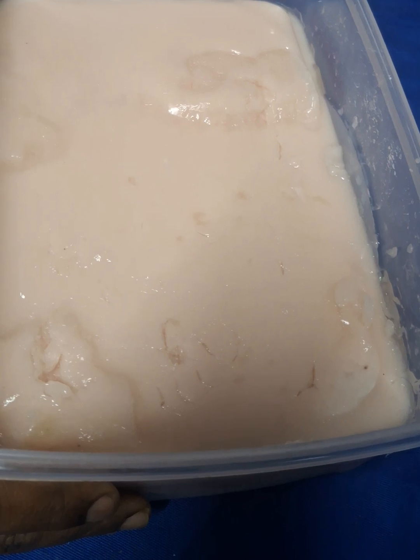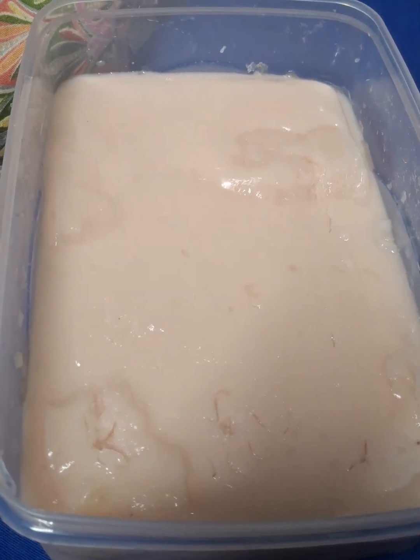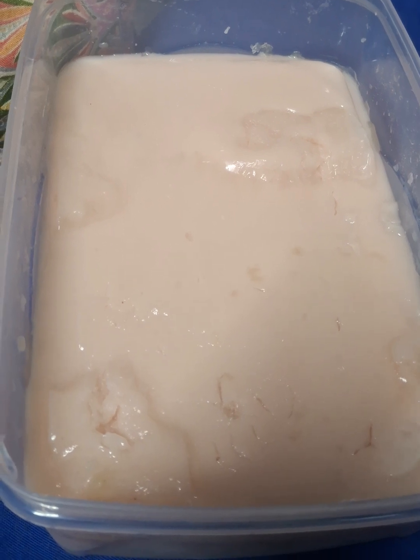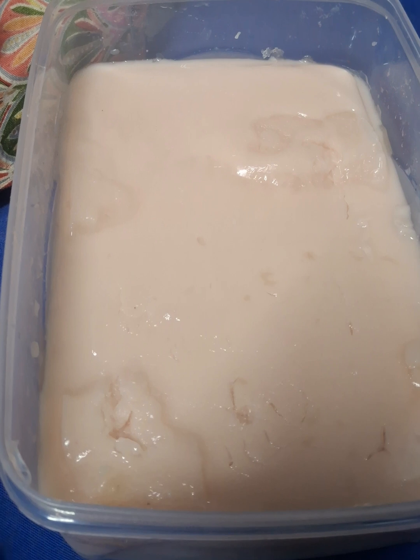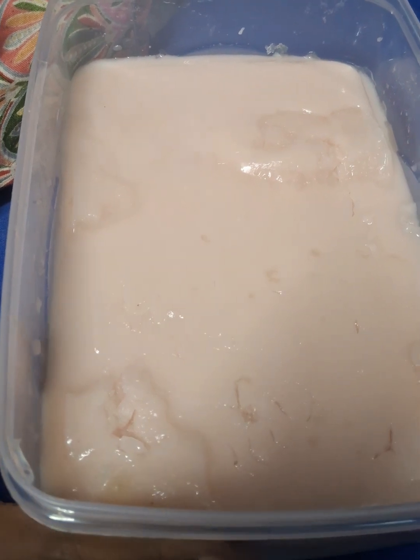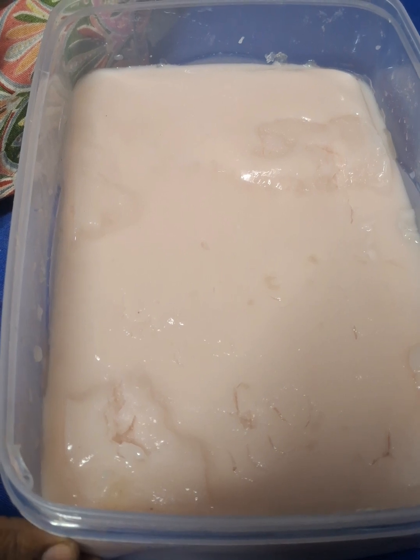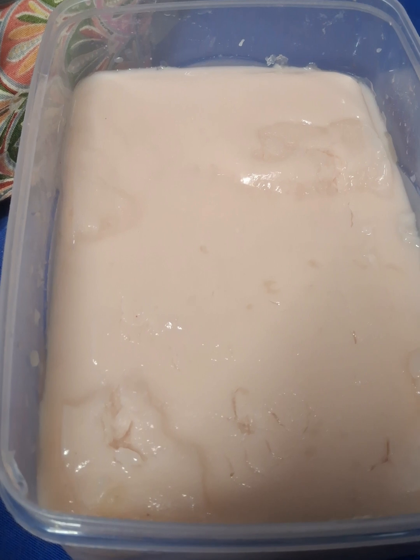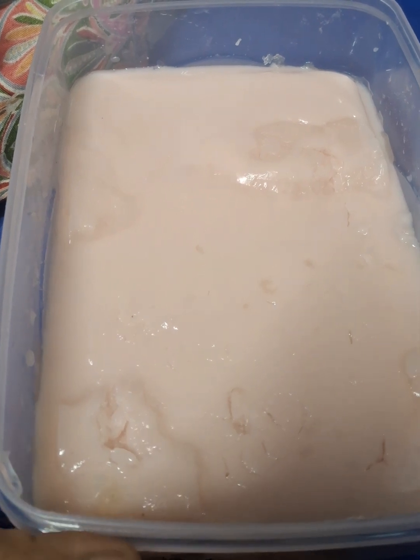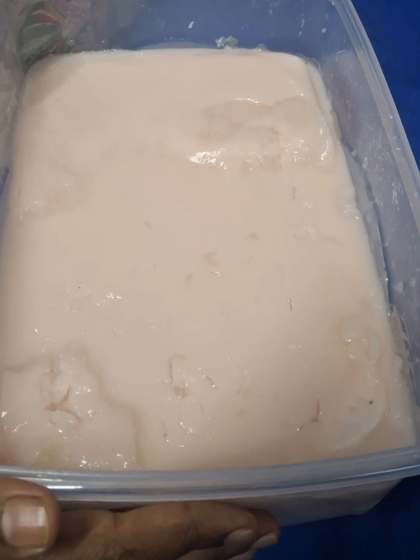We have prepared a USG phantom using gelatin powder. We boiled the water and mixed the gelatin powder in it, then kept it in the freezer to settle. We also mixed some color so that it gives a skin texture. This box, or USG phantom, can be used to practice USG-guided procedures.